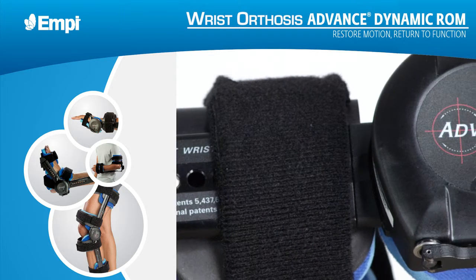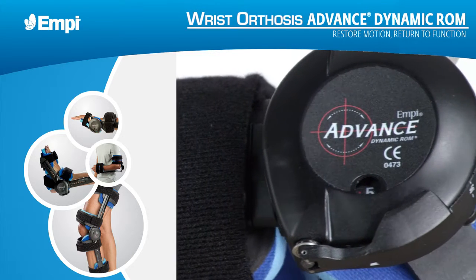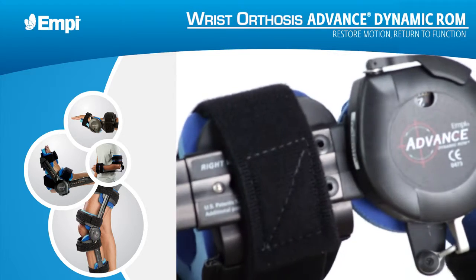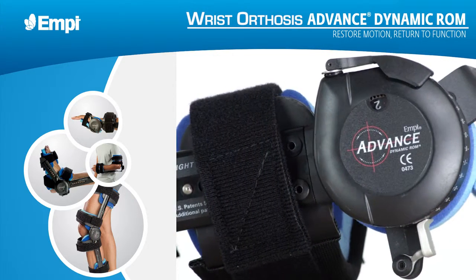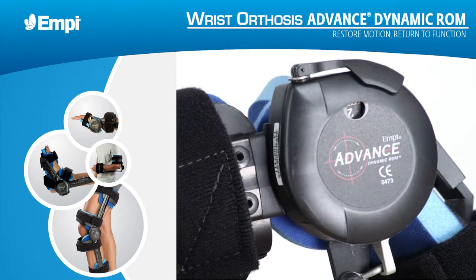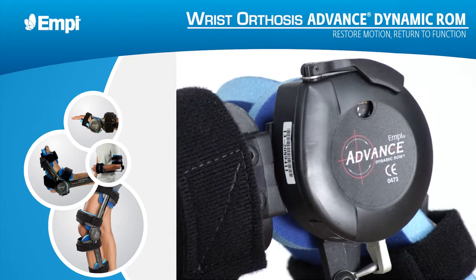The EMPI Advanced Dynamic ROM Wrist Orthosis is designed for a custom fit and comfort. By following the fitting instructions on a day-to-day basis, you'll help ensure that patients receive the maximum possible benefit for their range of motion therapy.